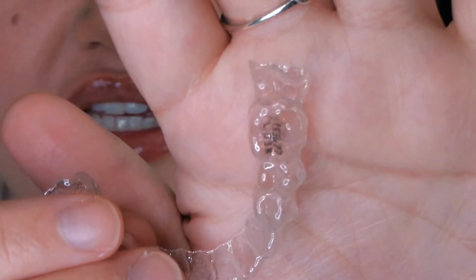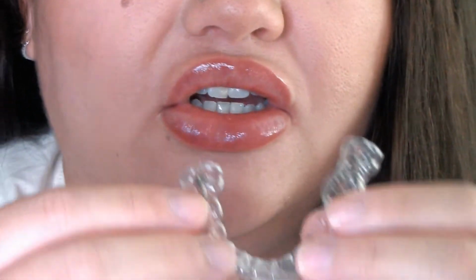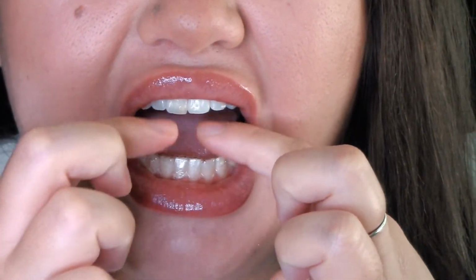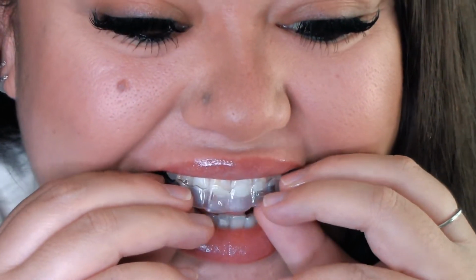So here's the bottom first, and again it has some information on the trays. If you ever get mixed up, it tells you what number it is. Okay, so here's the bottom. It pops in really easily. Every time I change the tray, it definitely feels tighter. So that's on there. And then the top is where I still have issues putting on, but let's see. Alright, so once it's on, I like to really push it on.